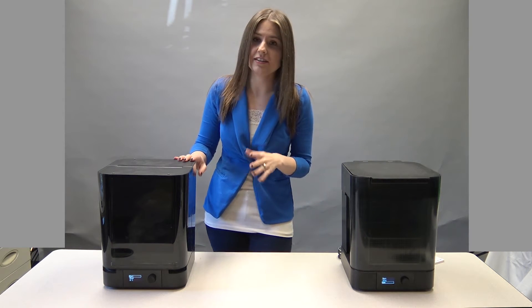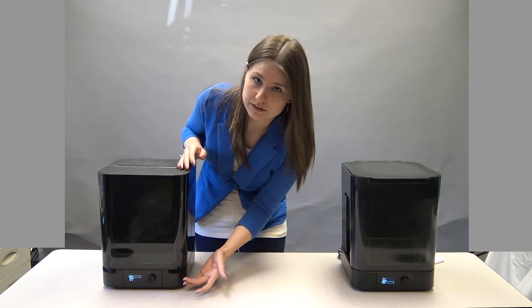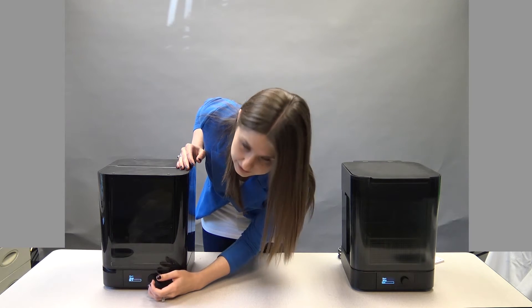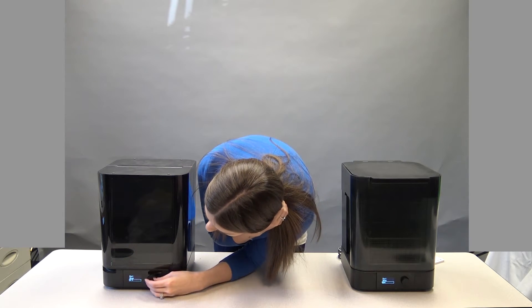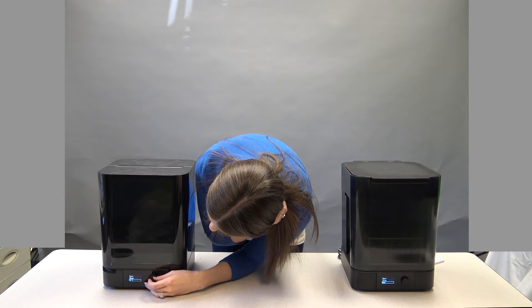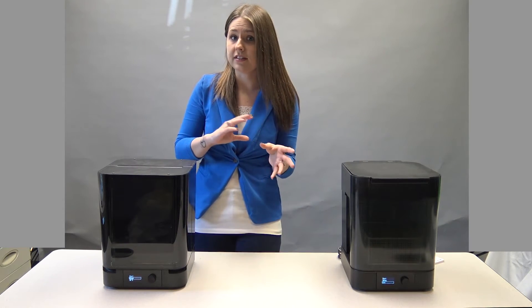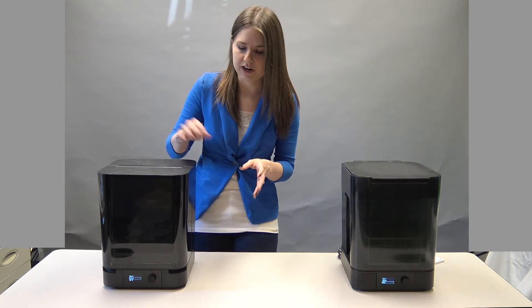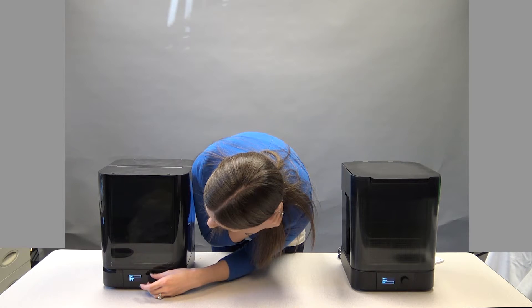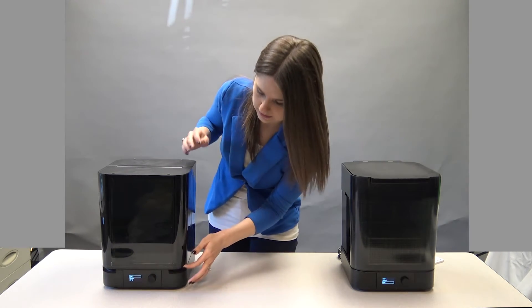Here's the Form Cure. The front panel is pretty much the same as the wash — the same turn knob with three selections, and you push it in for enter. We have start, you can set the times, and you can change the temperature. Right now I'm set for 30 minutes and 35 degrees Celsius.